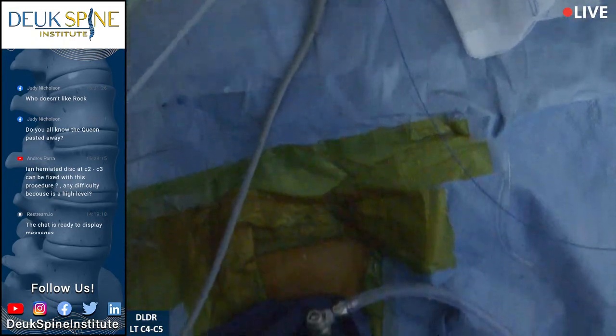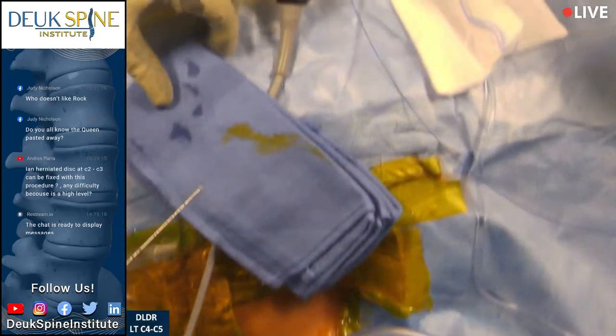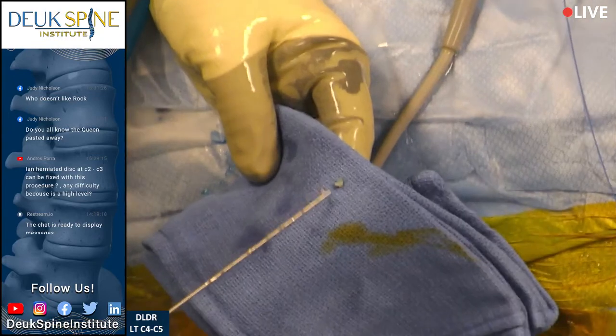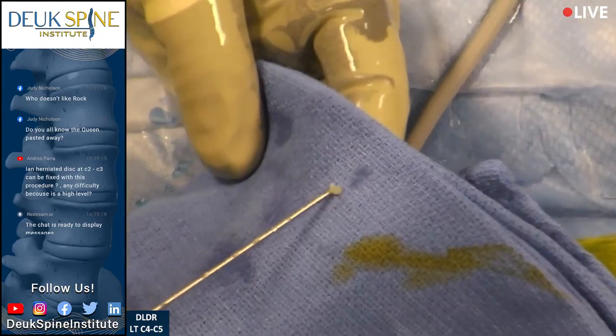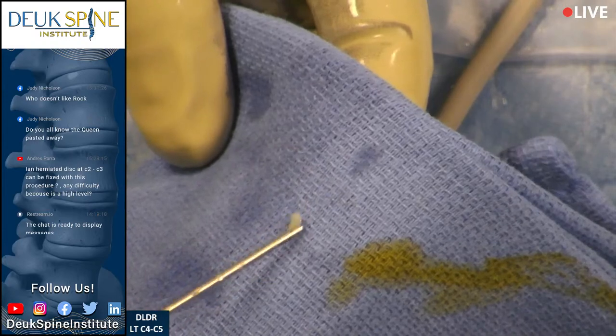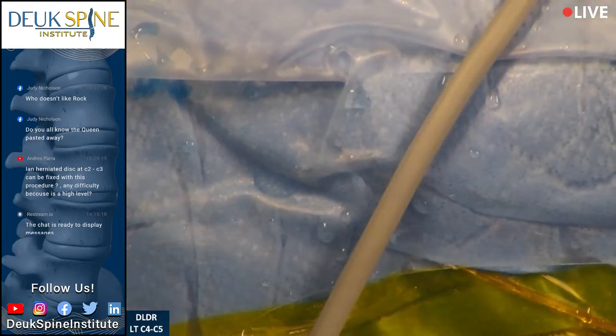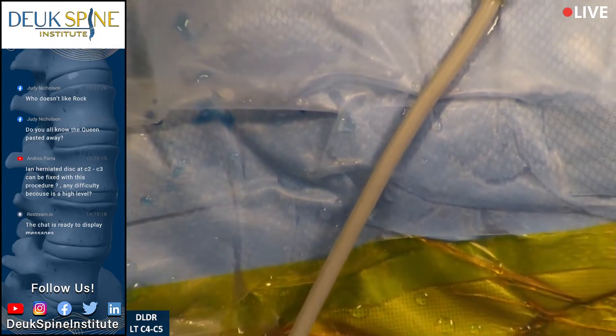No fusion necessary. It's so sad that surgeons are so far behind the times — if they could just do this, it would save people so much pain and suffering. Let's show them the herniation. It's about two millimeters by two millimeters by two millimeters. It's a little hard, so it's not a calcified disc herniation.